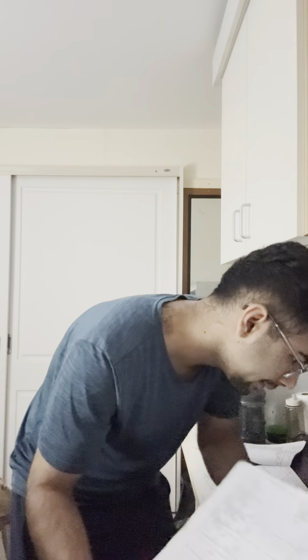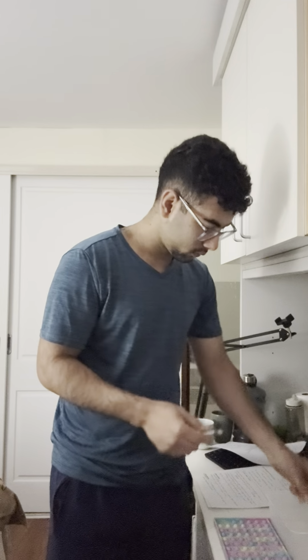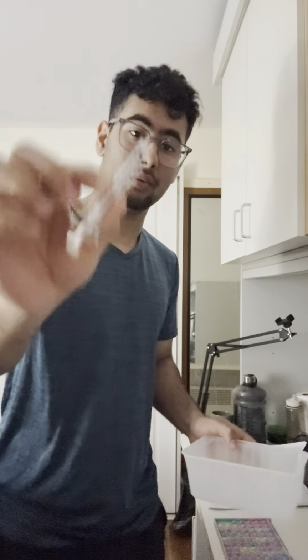I did have it here till yesterday, but just right here. All right. So for me right now, I don't have the insulin syringe, so I'm going to use this random syringe for now, just to give you an example of how to do it, right?